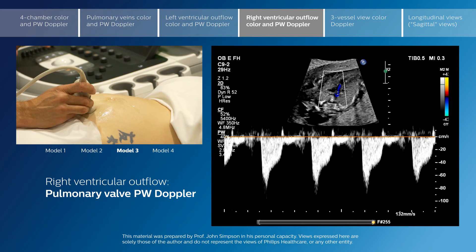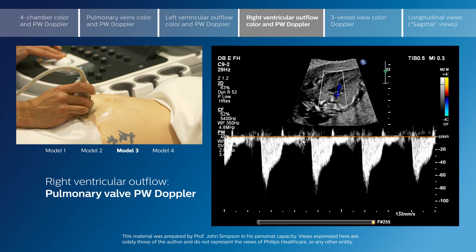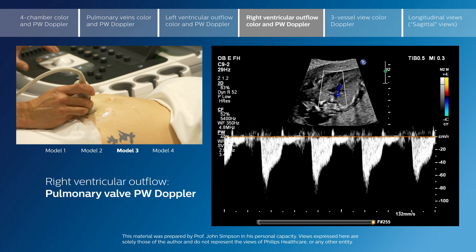You will see the closure click of the pulmonary valve, but also a slight extension of flow into diastole, indicating that you are up at the level of the arterial duct rather than at the level of the pulmonary valve — which is an important distinction.